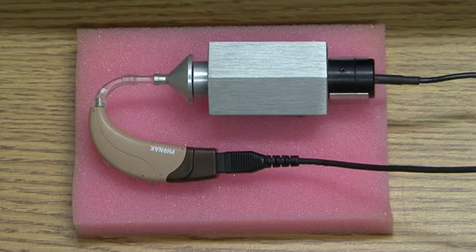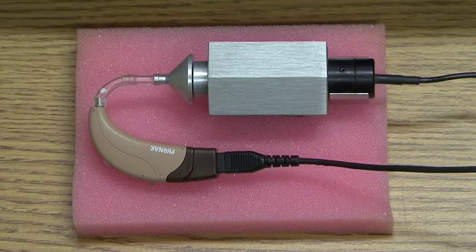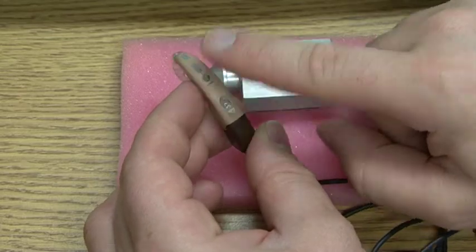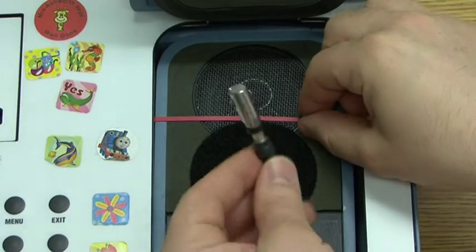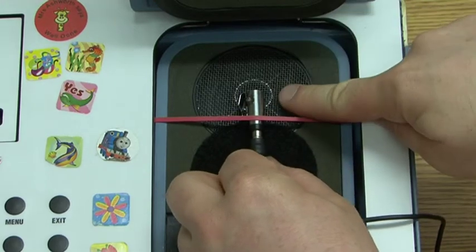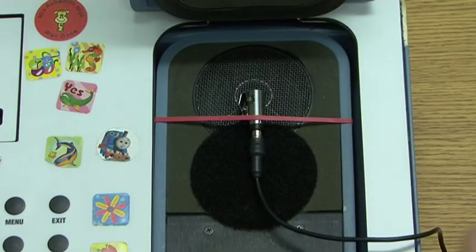Place the hearing aid and coupler carefully onto a soft surface. Ensure that the hearing aid is on the correct program. Place the lapel microphone of the transmitter onto the center circle of the loudspeaker as shown using the elastic band to help hold it in place.